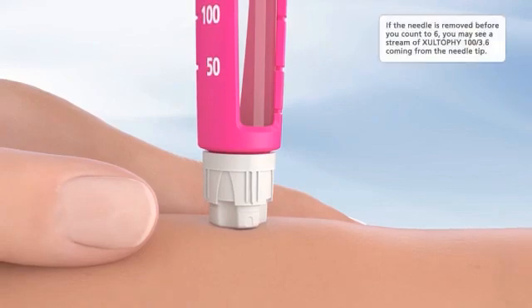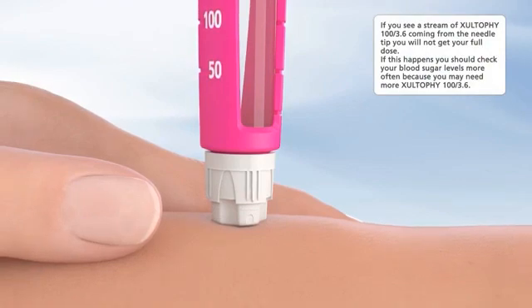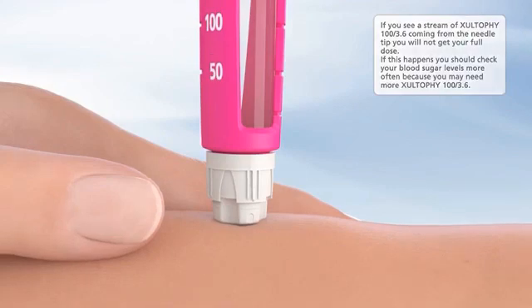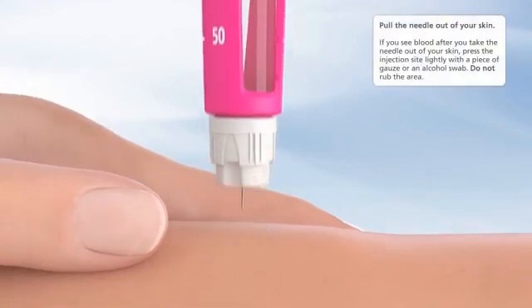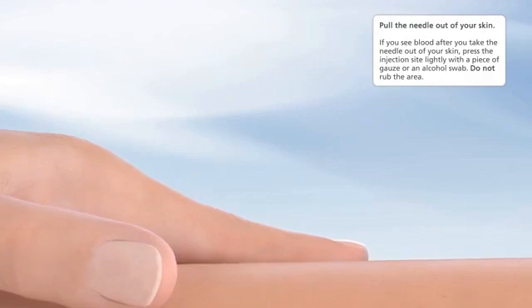If the needle is removed before you count to six, you may see a stream of Zultify 100 3.6 coming from the needle tip and you will not get your full dose. If this happens, check your blood sugar levels more often because you may need more Zultify 100 3.6. Pull the needle out of your skin. If you see blood after you take the needle out, press the injection site lightly with a piece of gauze or an alcohol swab — do not rub the area.